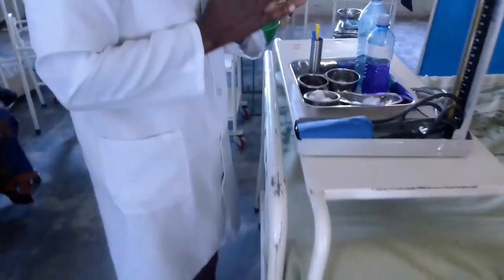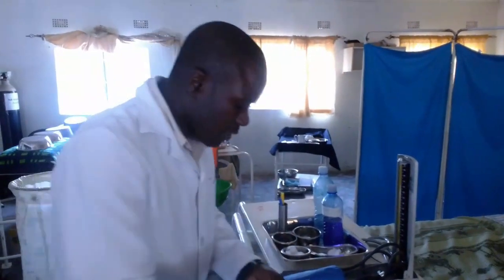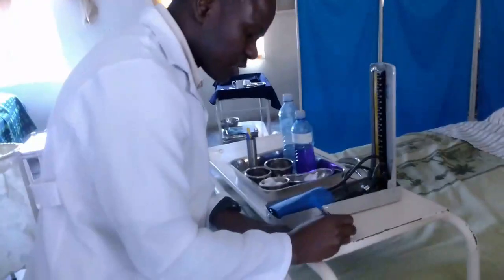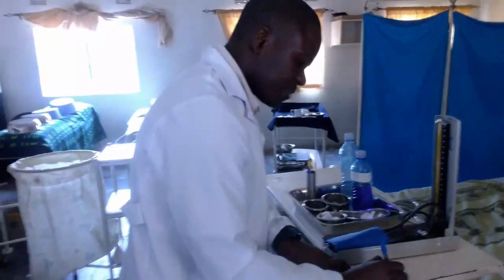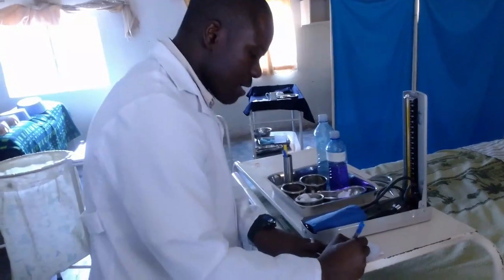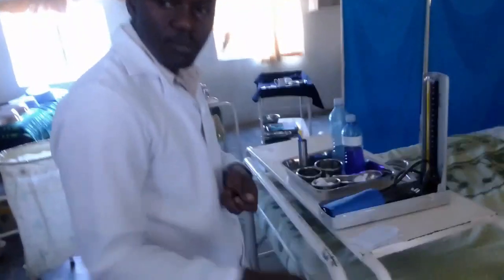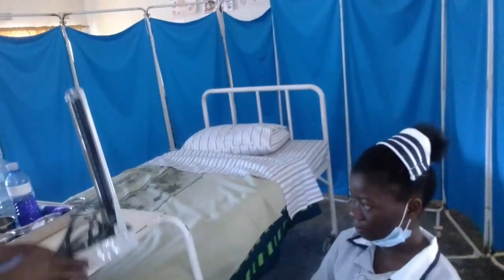Okay, so at this moment, we have done temperature, pulse, and respirations. If you can't master them, you can write them down. That's temp at 36.5 degrees Celsius. Then pulse rate, which is PR, 65 beats per minute. Respiratory rate, we've counted 18 breaths per minute. Then what about the BP, which is the blood pressure? Now we need to find a table or a chair, so that we go down to where the patient is and do it nicely. So let me just get a chair.